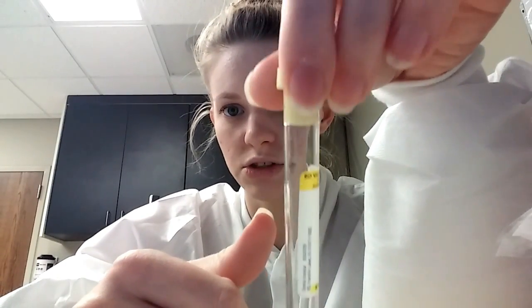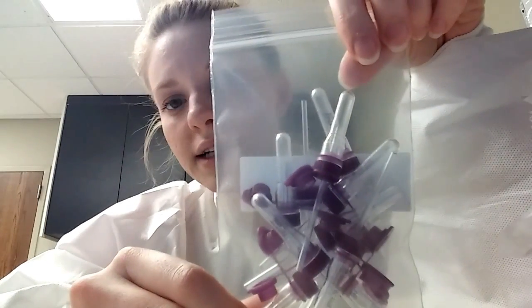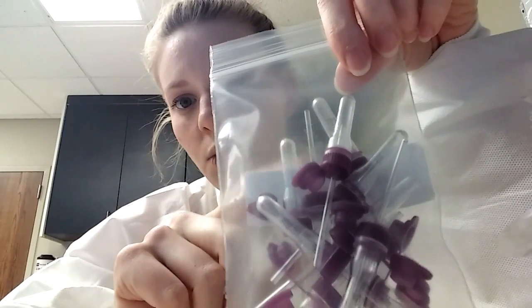This yellow tube is an ACD solution B. I don't really know a whole lot about this tube — it's usually for tissues or if something's going to be checked by flow cytometry, like for cancer cells or antigens on the cancer cells. It's not a very common tube, but this is the yellow tube — not to be confused with the gold.